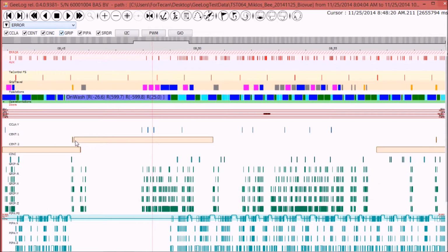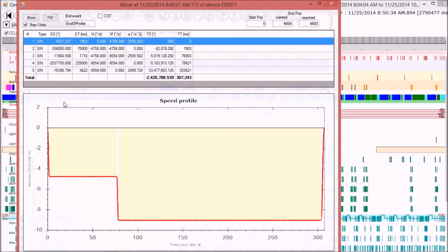So during this period represented by the rectangle starting here exactly at 8:45, 26 seconds, up to 8:50, in this case represents a spinning of a centrifuge. If you click on the right mouse button on it, you will see a profile. So this dialog shows a number of kinematic properties of this profile and the mathematical graphical representation of the velocity on the vertical axis versus time.